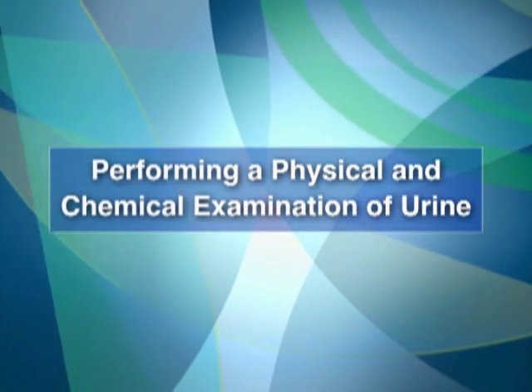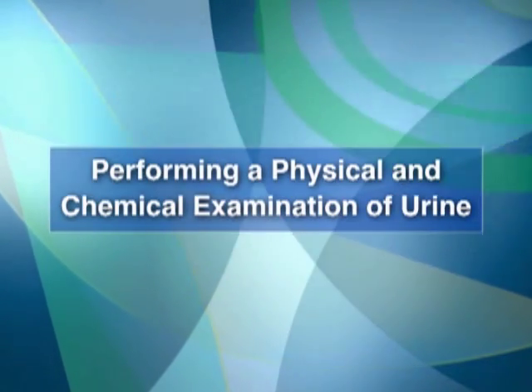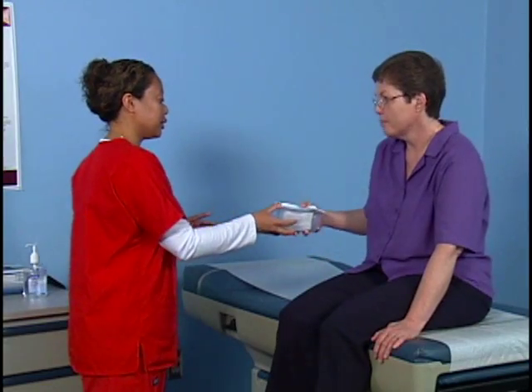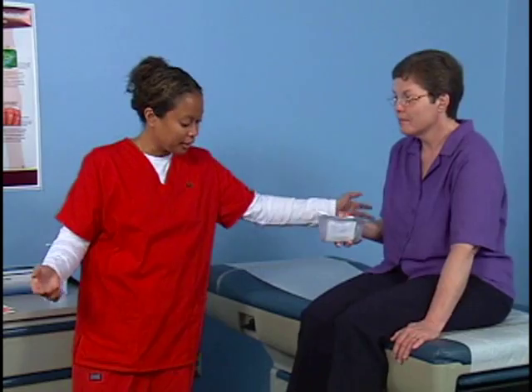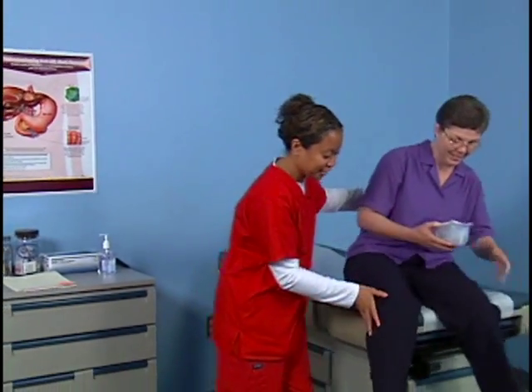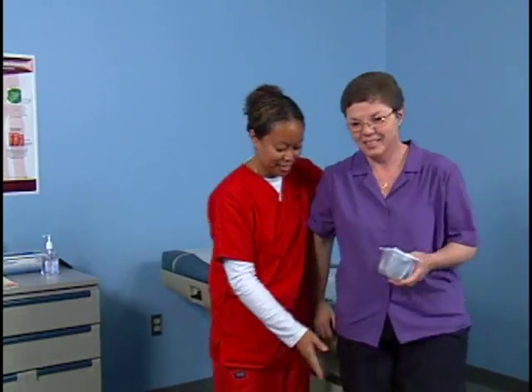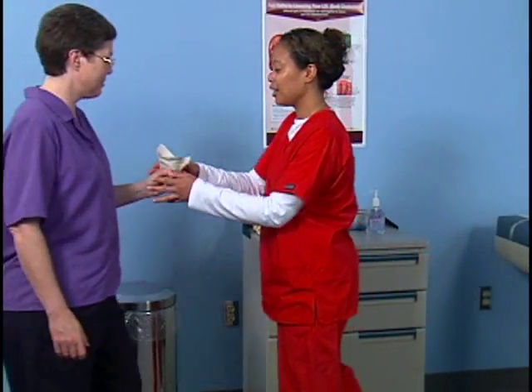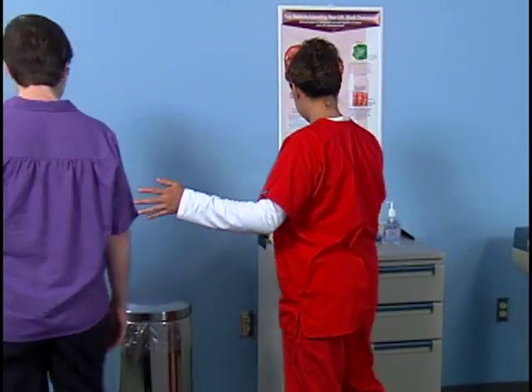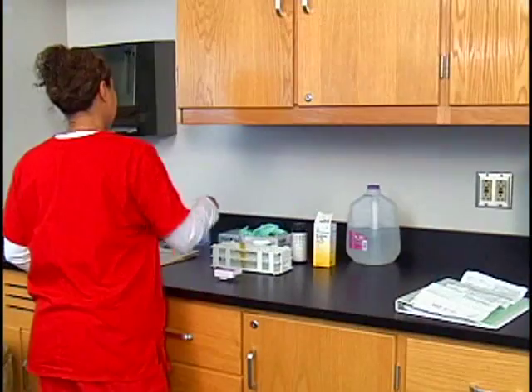The medical assistant will now perform the physical and chemical examination of the urine specimen. Begin by obtaining a freshly voided urine specimen from the patient using a clean container. A first voided morning specimen is preferred for the Multistix test, but a random specimen is acceptable. The container should be clean because contaminants in the container could affect the test results.